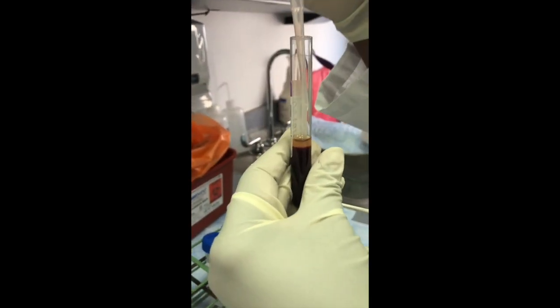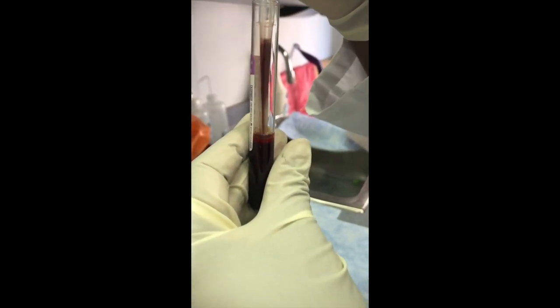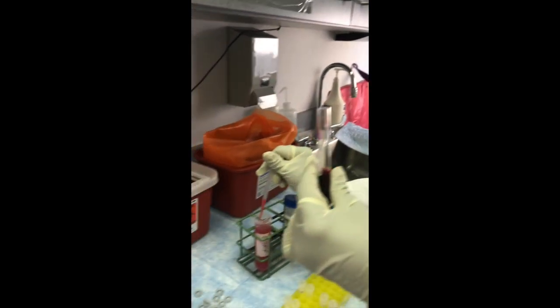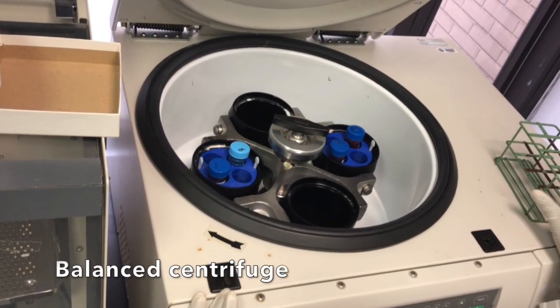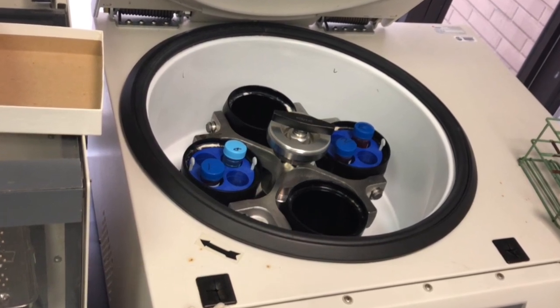Once all subject buffy coat samples have been transferred into the 50 milliliter conical tube, these 50 milliliter tubes will be incubated for 20 minutes at room temperature under a hood. After 20 minutes, the 50 milliliter conical tube will be placed into a balanced centrifuge and spun for 20 minutes at 2,500 rotations per minute.